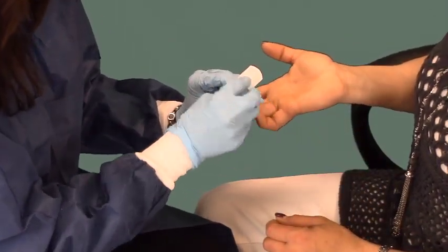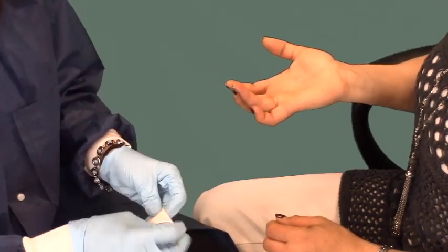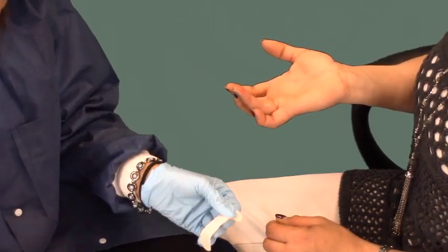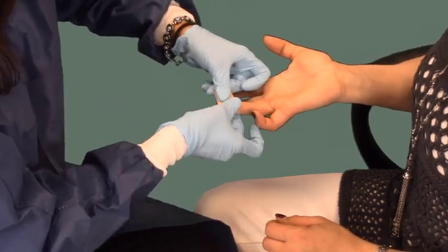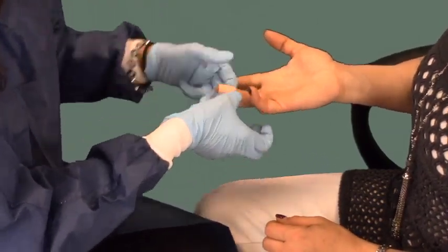Talk to the patient, parent, or guardian about the necessity of a bandage. These may be choking hazards for very small children. Once you're finished, thank your patient, parent, or guardian and answer any questions they may have.